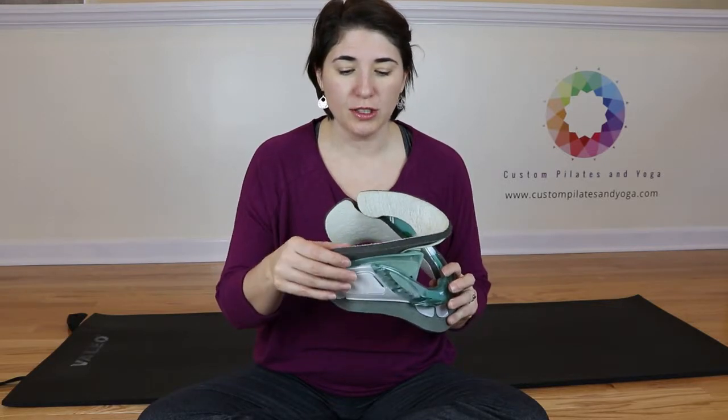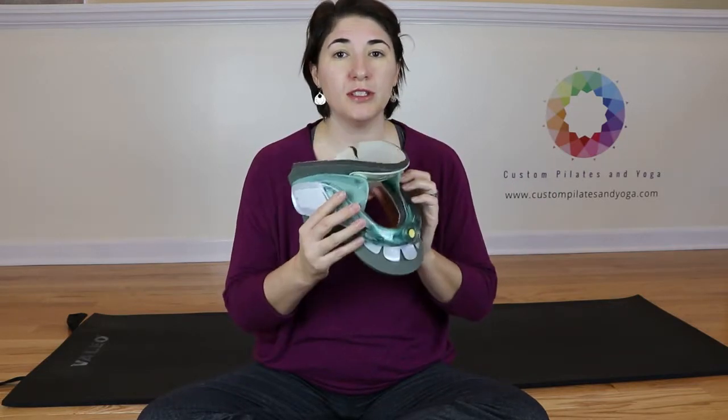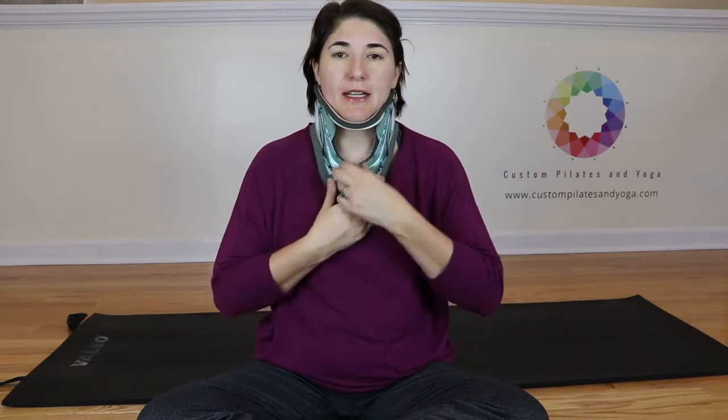So once you have your collar set up and you're all clean, your collar's adjusted — you're going to take your collar. I always did my front part first. So you get yourself set and you should be able to rest your chin on the plastic.